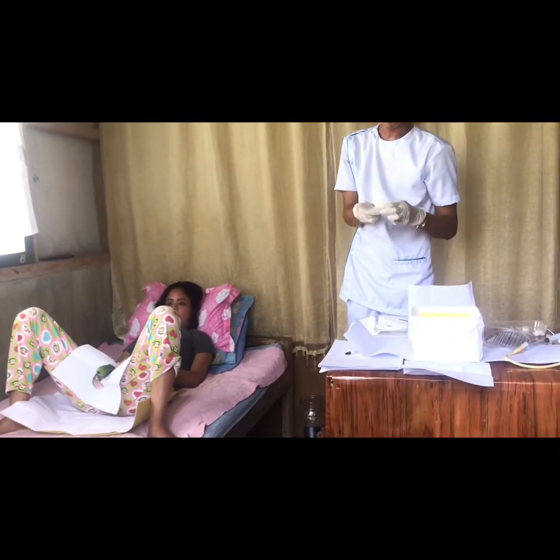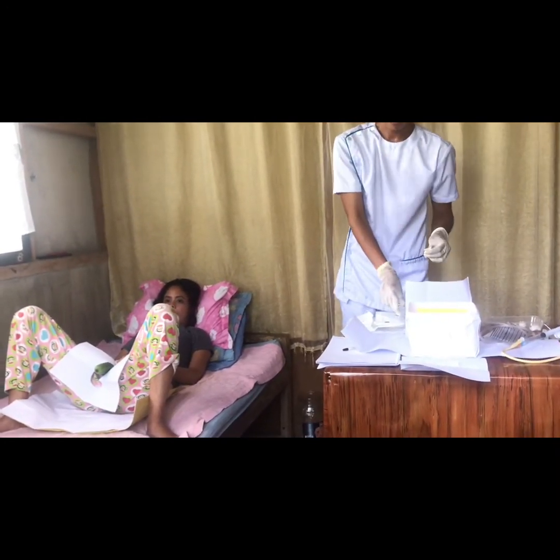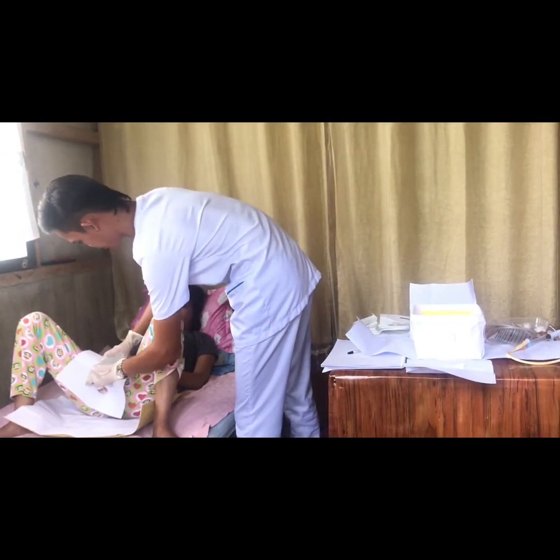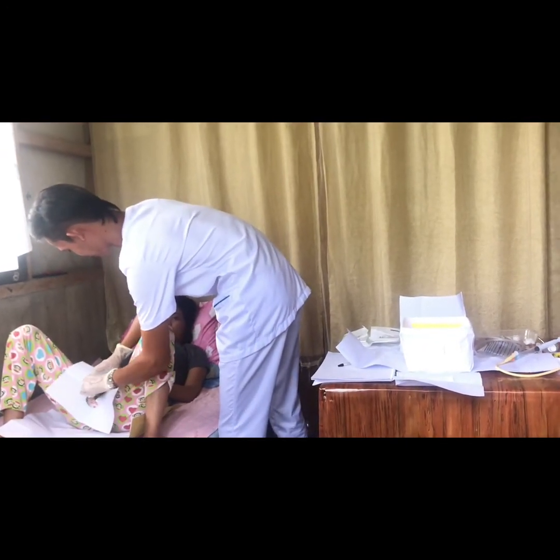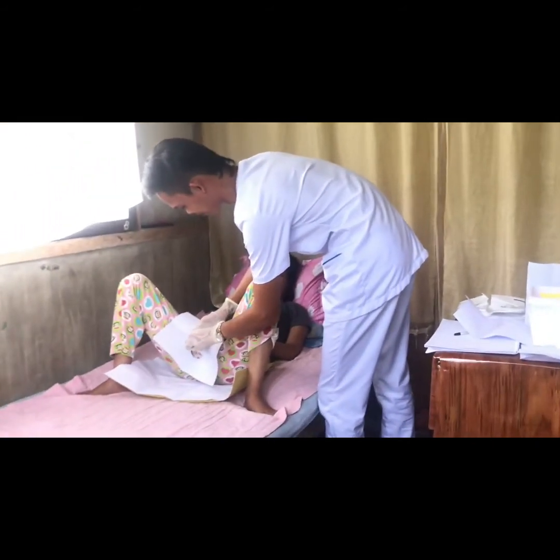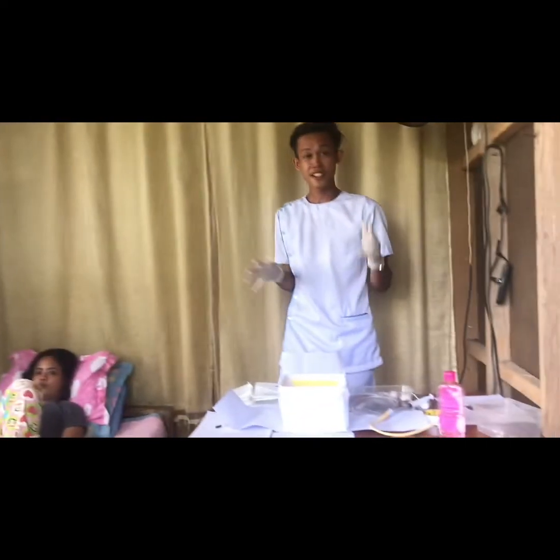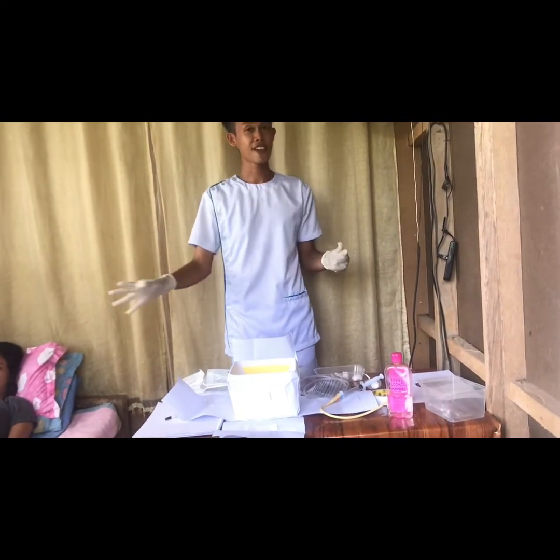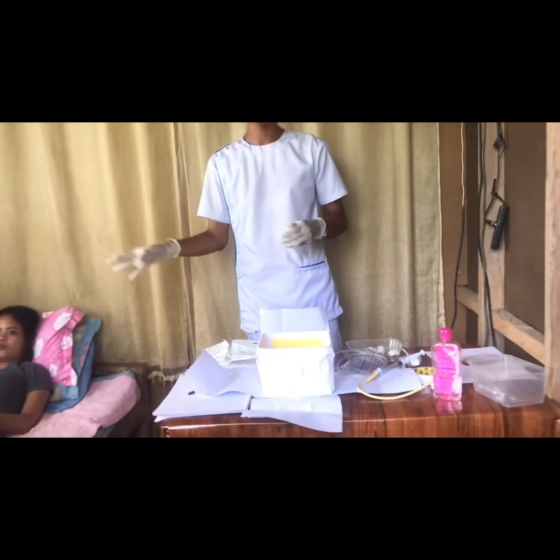Lastly, this is used to clean the center portion of the penis. Are you okay, sir? Yes. Okay. So this time, we're going to dispose of it. Okay, so for today, I was able to do the second stage of cleaning for the penis of the patient.